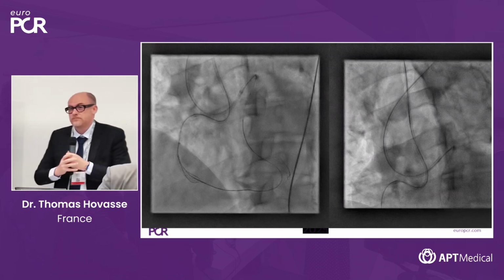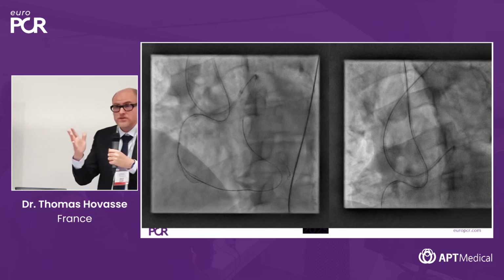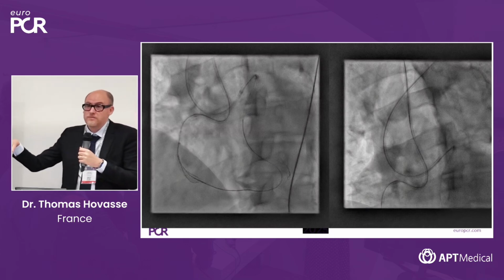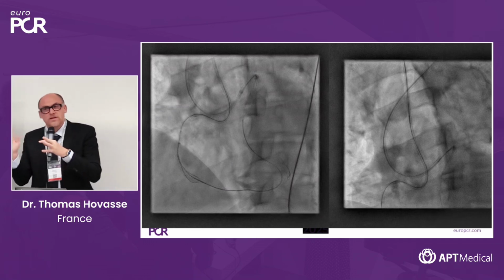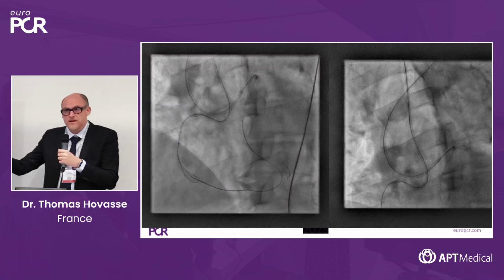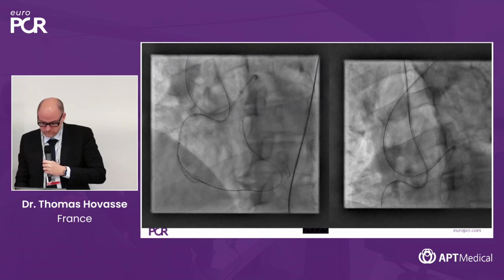If the 3.0 won't work here, you would go with a bigger balloon, the size of the knuckle most probably, because you want to touch the knuckle. 3.0, 3.5 is okay because it's a very big right coronary. For sure, if the artery is 2.5, don't take a 3.5 balloon. But in this case, it's a really big right coronary.